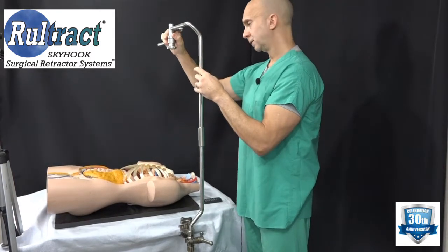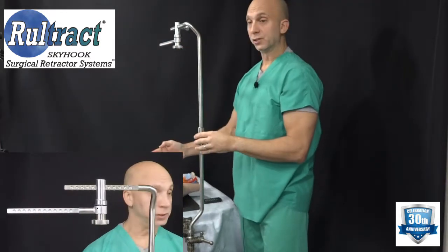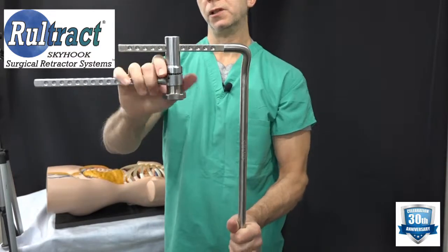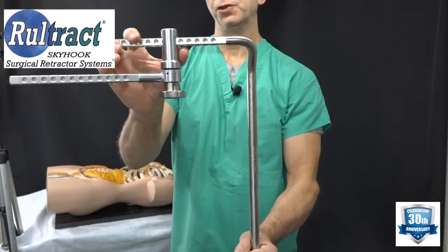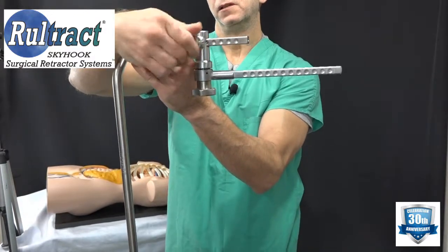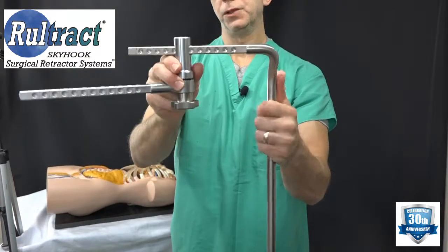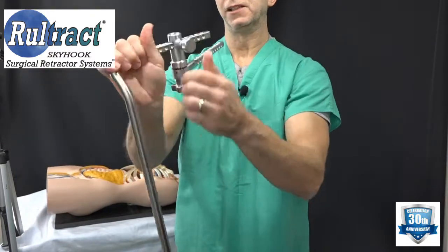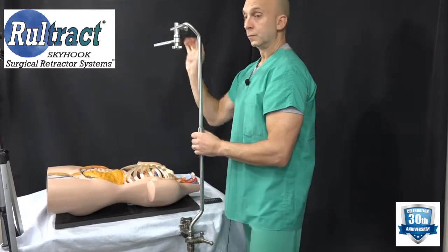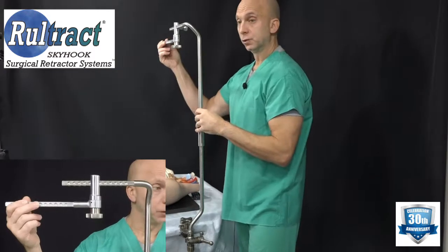Slide the extender bar onto your top post and lock it into position so that it comes out over the center of the patient's chest. There are detents or holes on all four sides of this top post, so once you find a position you're comfortable with, tighten the knob and make sure it goes into one of the detents. You can see it's locked into position and will not come off once the lock knob is tightened. Then turn the knob to lock the rotating extender bar fully into position.